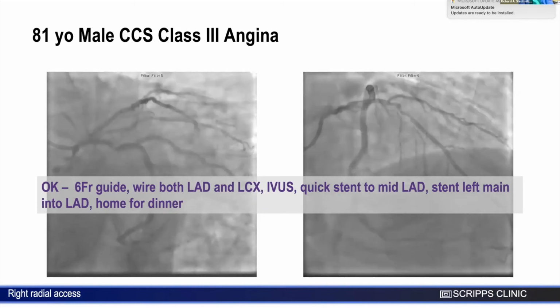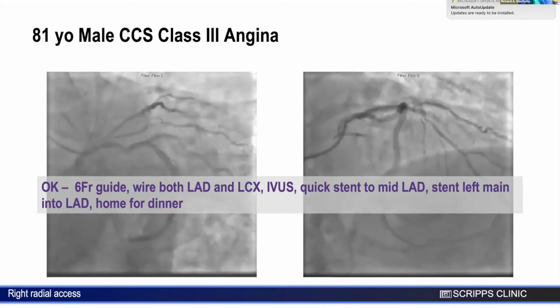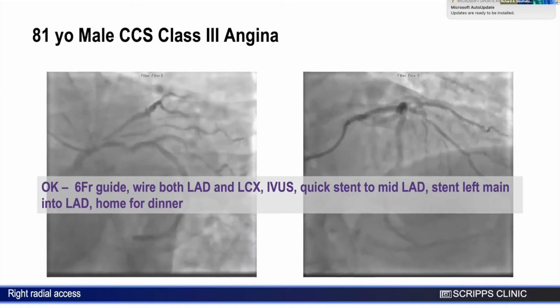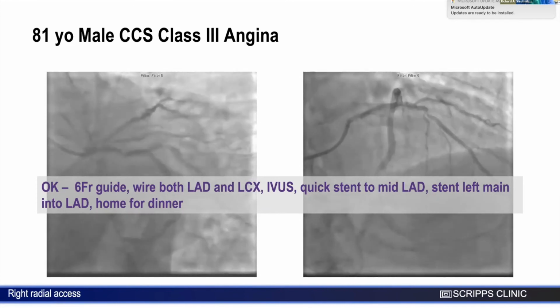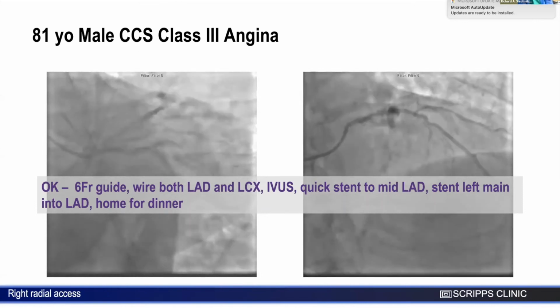Matt, can you tell from an IVUS run, and I'm not an expert in IVUS like you are, when I OCT and I have side branches, I make decisions about how worried I am about the side branches. You really can see very crisply the origin of the side branch. Can you tell that on IVUS there? No, I don't think so.